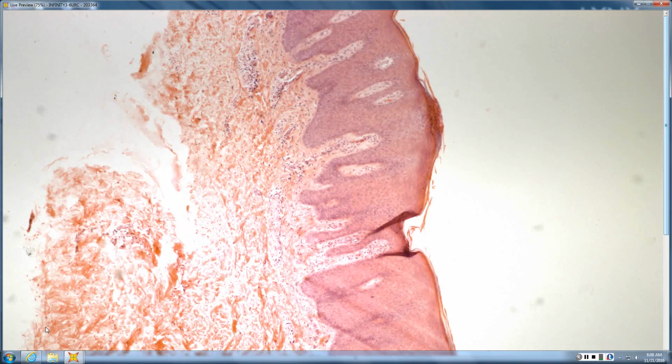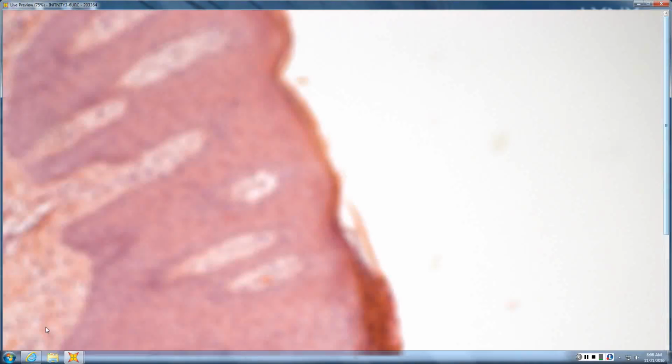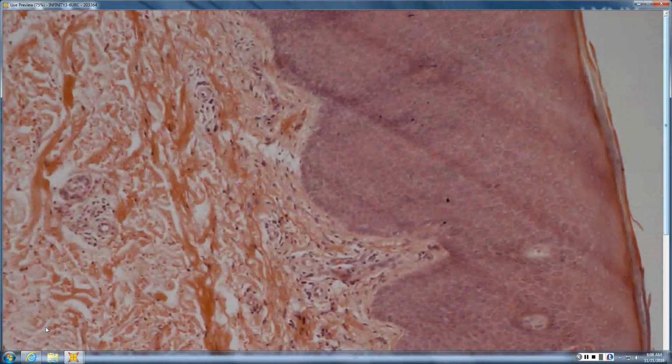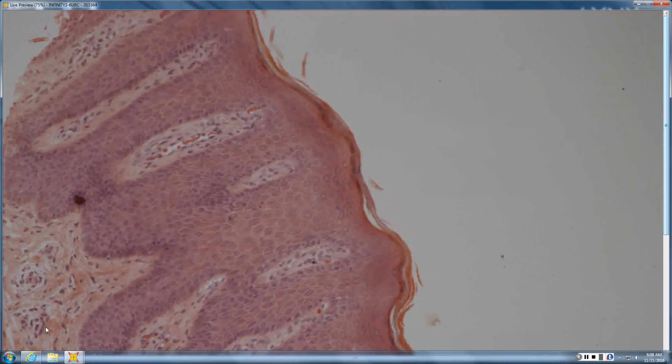I think for the group we were looking at, like the other cut that was on the slide, there's an active cut, and then if you go to the other side, that's the one we were looking at. So it's still there, but it's neutrophils just in the horn, and it's not as busy of a dermis. That is absolutely true. So it's not as helpful to tell you it's not something else.